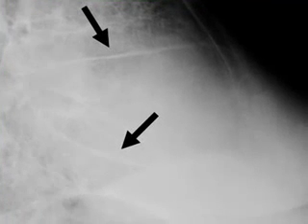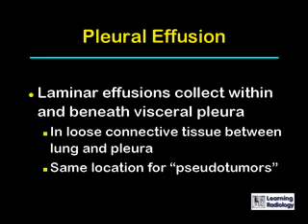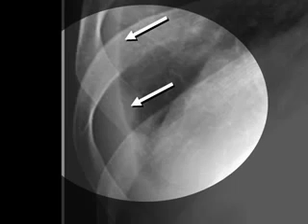Pleural effusions occur commonly with congestive heart failure. Laminar effusions are effusions that collect within and beneath the visceral pleura in the loose connective tissue between the lung and the pleura. This is the same location in which pseudotumors or vanishing tumors collect in some patients with congestive heart failure. This is an example of a laminar effusion. Normally, the air in the lung extends to the interior portion of each rib, but in this patient, the white arrows point to a white edge representing the laminar effusion, shown by the double black arrowhead indicating the thickness of the effusion.